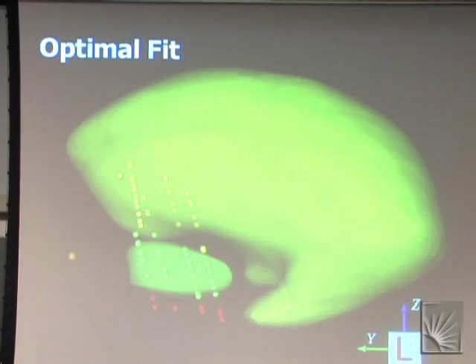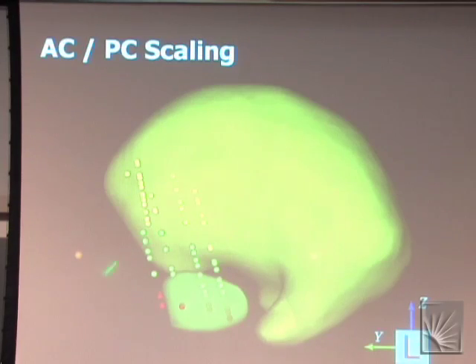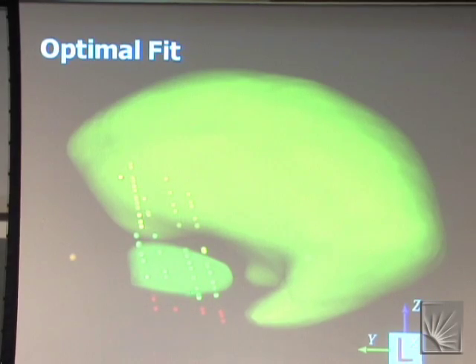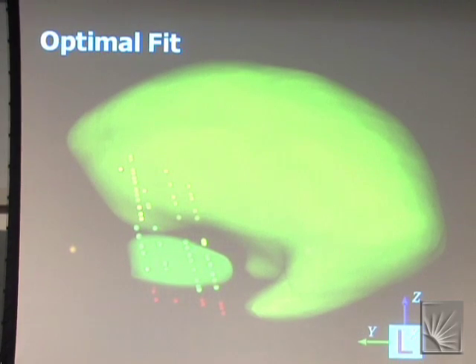So that's what Luis did, and he came up with these very elegant algorithms that very quickly cycle through all of this microelectrode recording data and permute the brain atlas in these sort of goal-directed searches, such that you go from this, the initial starting point or the initial conditions, to this, which is this optimized fit, where we've weighted the selection or the placement of the brain atlas to match as closely as possible with the microelectrode recording data.